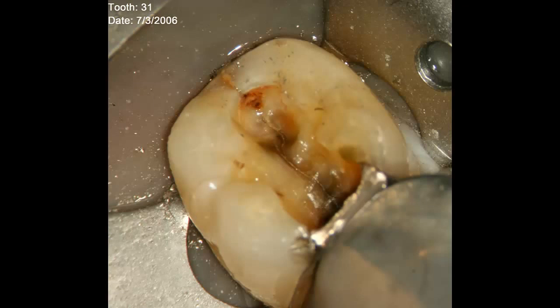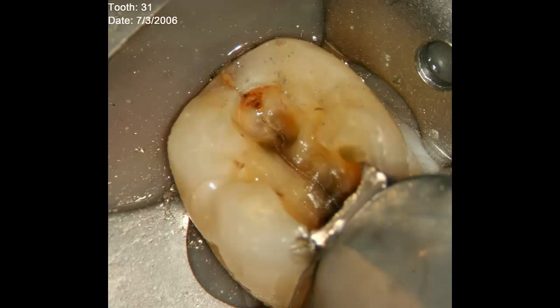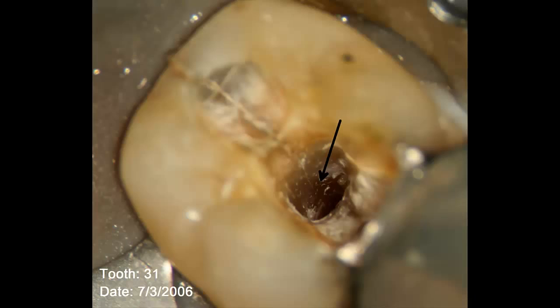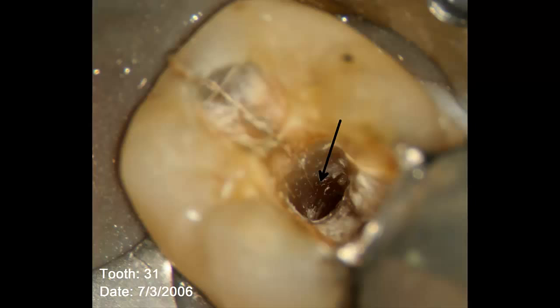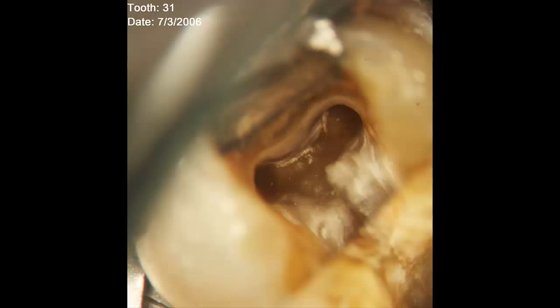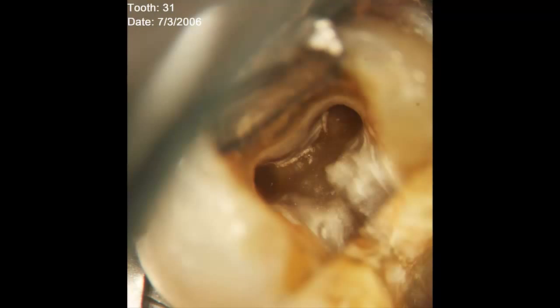When transilluminated, the tooth revealed a distal buccal cusp fracture, which you can see on this clinical photomicrograph. Removal of the restoration revealed a crown fracture coursing through the distal marginal ridge. As the initial access was performed, the crack could be traced one to two millimeters into the distal wall of the distal canal orifice. The dentin was also quite stained with arrested caries; it did not stain with caries indicator dye.